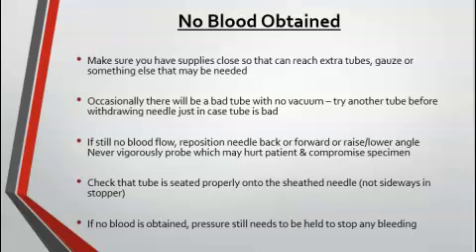Remember, the needle in the arm needs to be about 15 degrees, no more than 30 degrees. We never want to vigorously probe the arm because we might hurt the patient, or we may compromise our specimen. We don't want to cause any hemolysis of our red blood cells.